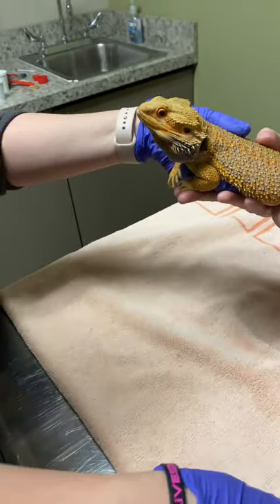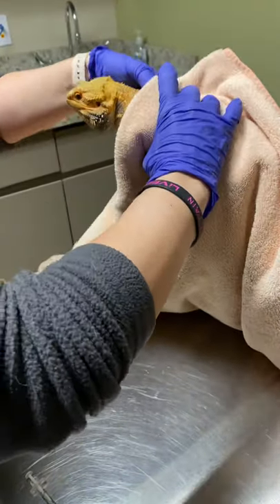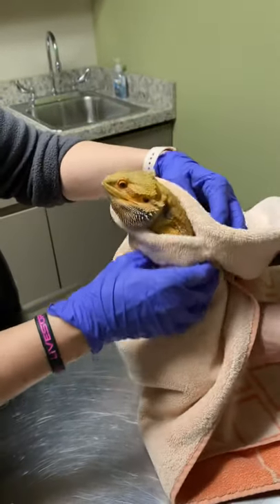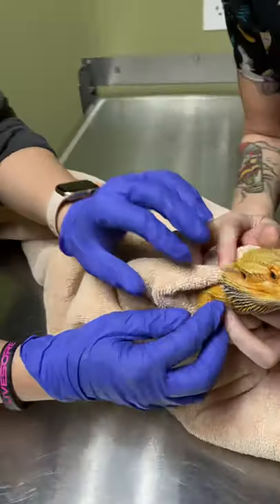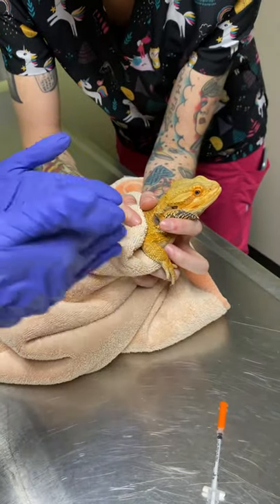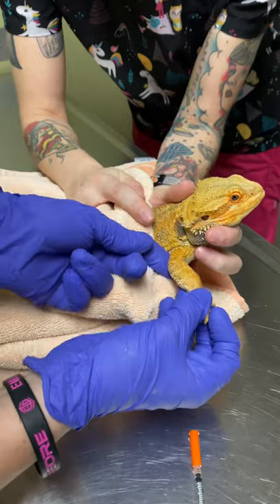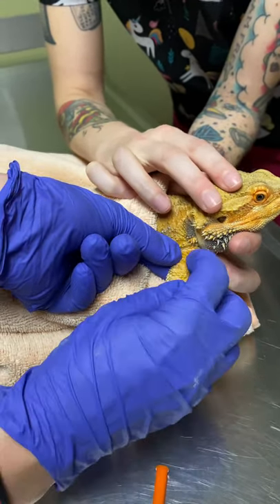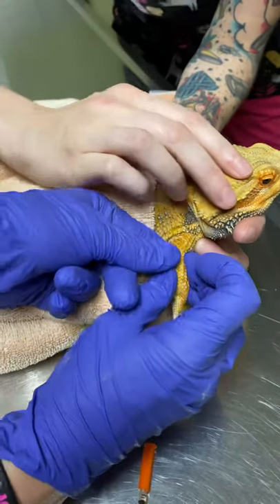We're going to go ahead and wrap him up a little bit because he's anxious to get away. She's going to go ahead and hold his head because sometimes they will get upset or defensive when we're poking them with the needle and they will try to do a little nip. I feel for the meaty part right there — the bone is kind of straight in the middle, and I'm going to go in between those scales.